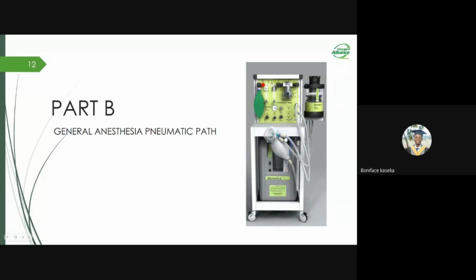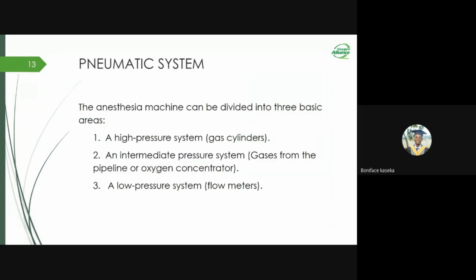Thank you so much, Foster. My name is Boniface Kaseka, and I'll take you through the general anesthesia pneumatic part. So generally, when we are talking about the pneumatic system, we're talking about pressure, the gases, as well as the liquids that are involved, and the safety measures that are put in place to make sure that these parameters work in conjunction with each other.